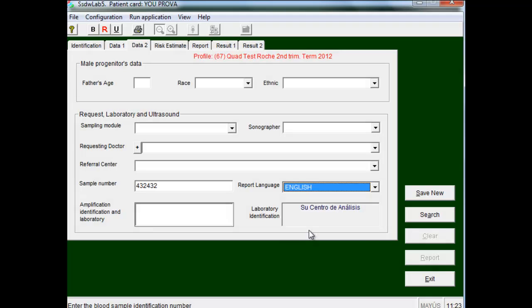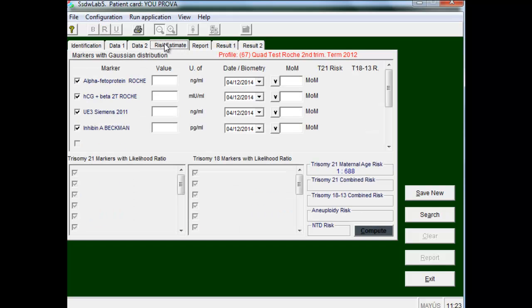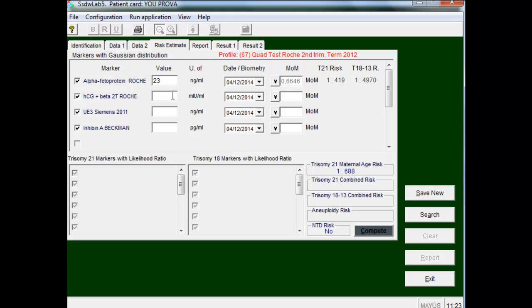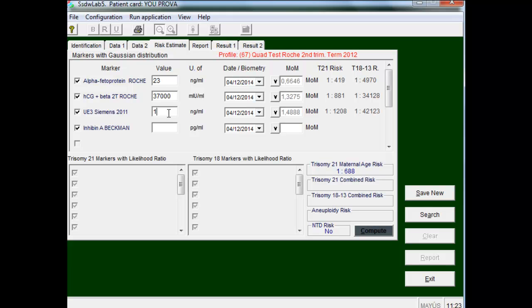In the following folder we introduce the alpha-fetoprotein value and we can observe that it automatically presents the multiple of the median. Then we enter chorionic gonadotropin value, in this case the total chorionic gonadotropin. The next biochemical marker is unconjugated estriol value, and the fourth parameter is inhibin A.